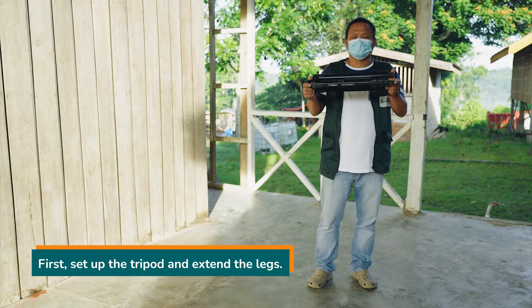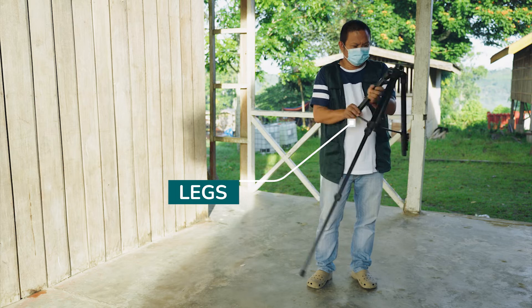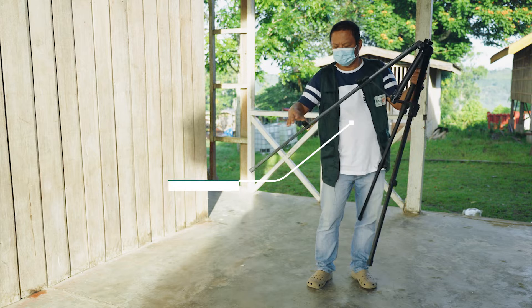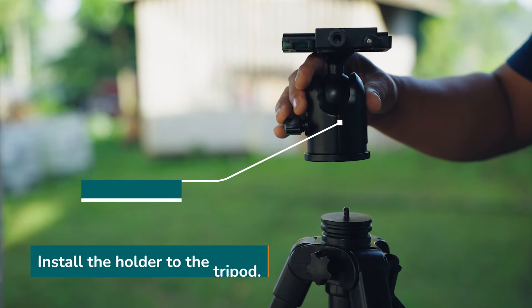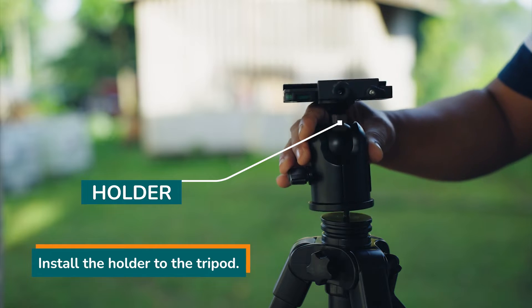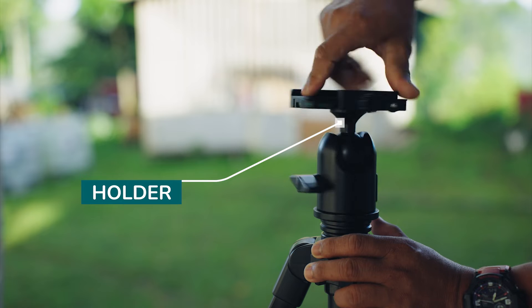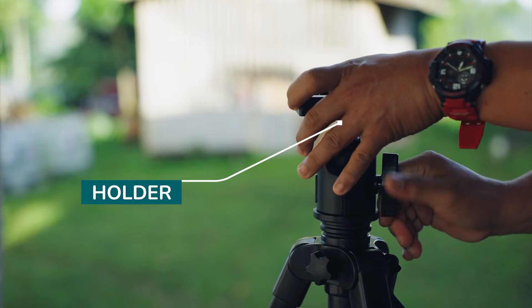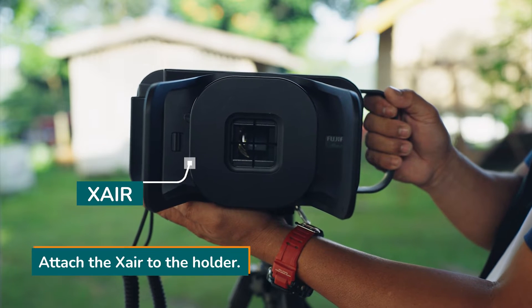First, set up the tripod and extend the legs. Install the holder to the tripod. Attach the X-ray to the holder.